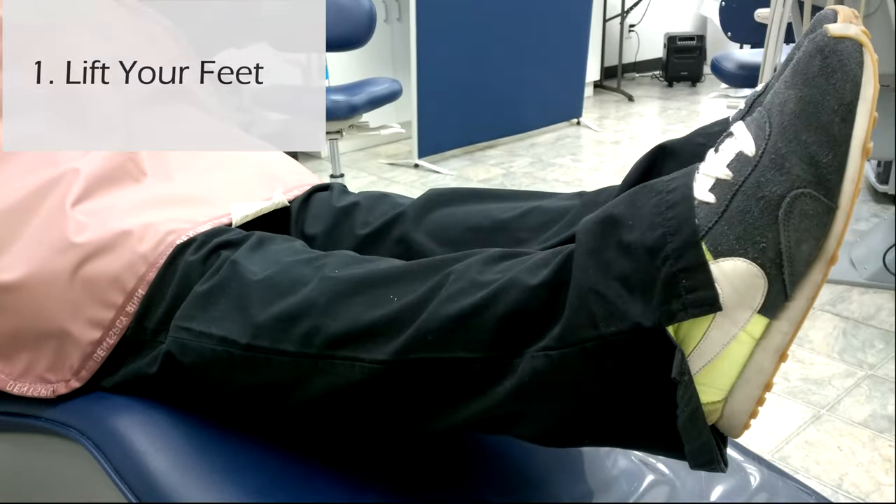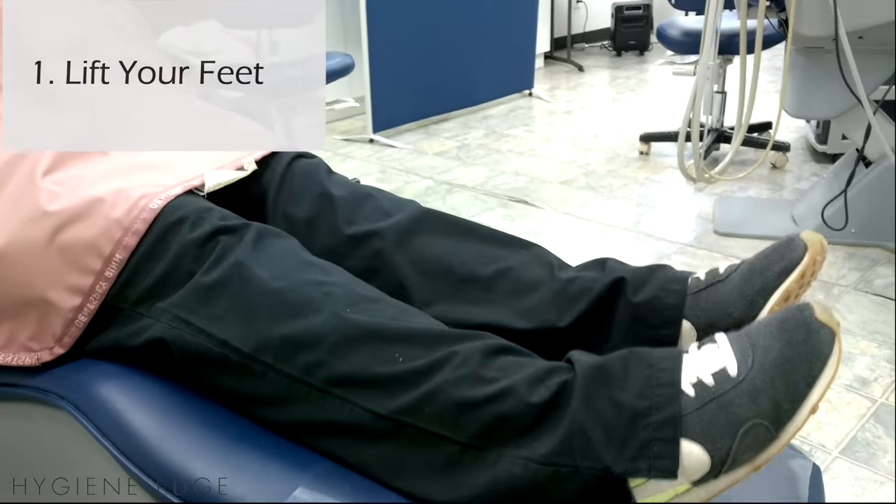Have the patient lift their feet. Lifting the feet helps flex the stomach, which helps reduce gagging.